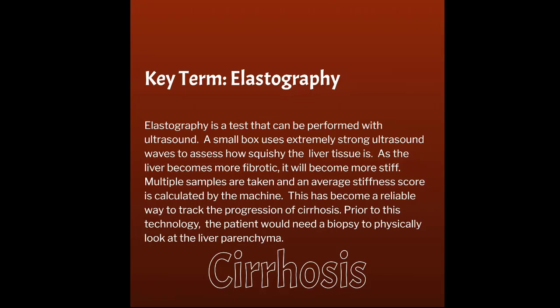And this is a really awesome tool that we have available to us now, because what used to have to happen is that these patients would have to go in and have physical biopsies of their liver, so they could see how stiff the liver tissue has become. With elastography, now we can do this in our ultrasound suites. We can do this every 6 months, not a big deal, and we can really track the progression of how stiff or how fibrotic the liver is becoming over time.